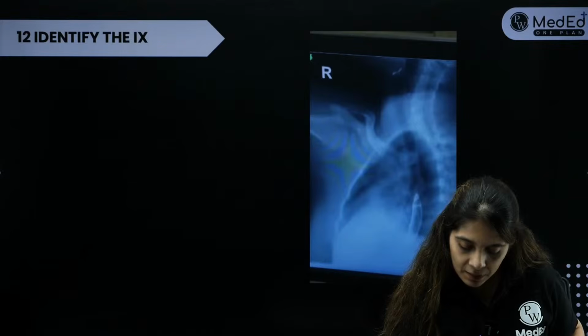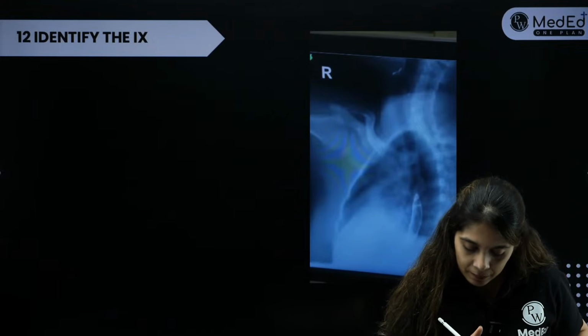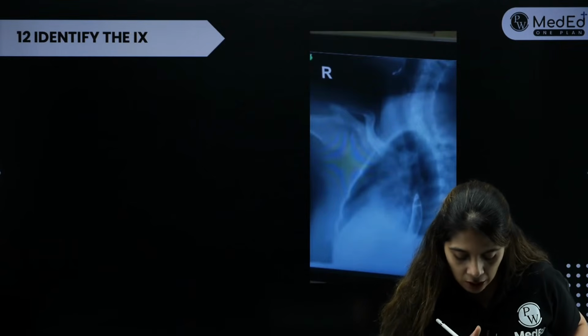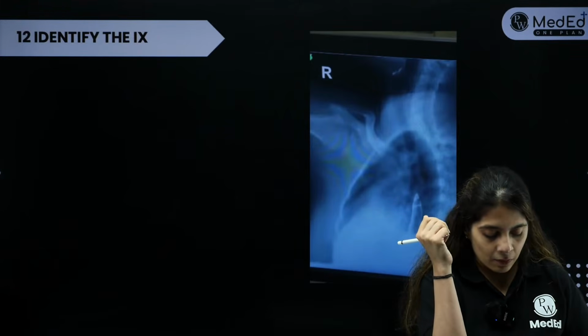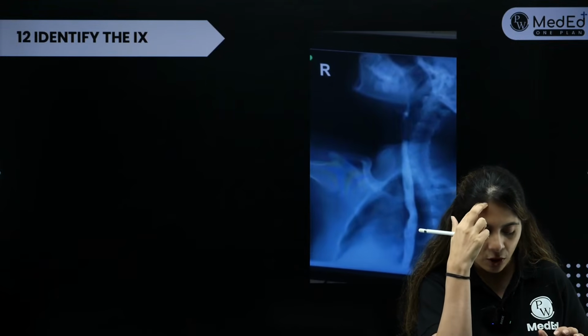Yes, Xavier, in the previous MCQ, the absent cranial vault is diagnostic. Yes, Ricky, it is barium swallow. Kunal, it is not barium meal, this is barium swallow actually which we are doing over here. And now tell me whether it is normal or abnormal. So the students get confused whether this is normal or abnormal.